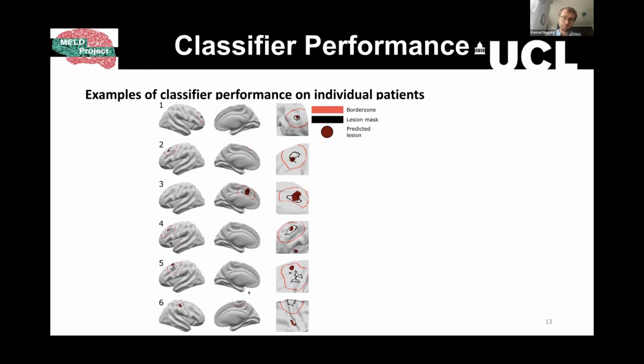And then the sixth example, it's close, but not close enough. That to us has to be considered a false positive because we can't go back to the original MRIs and check. So that's just a false positive.